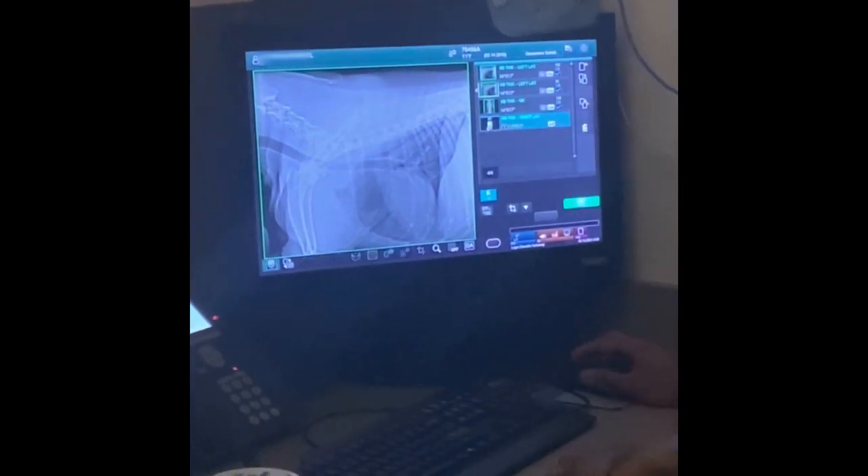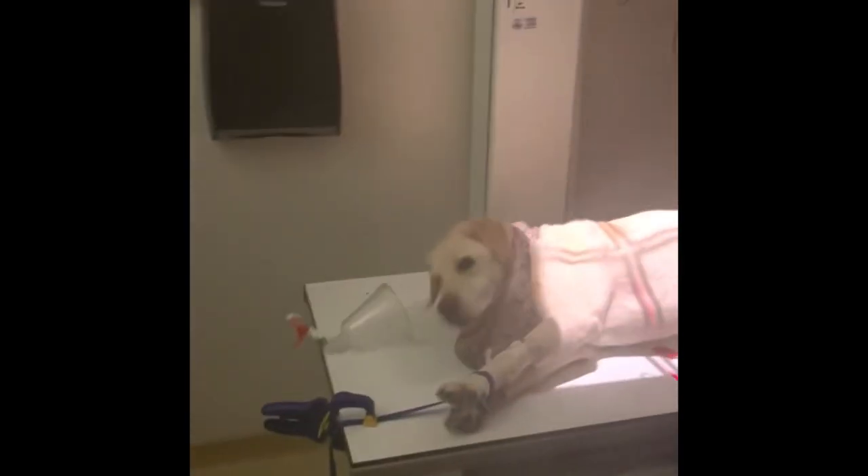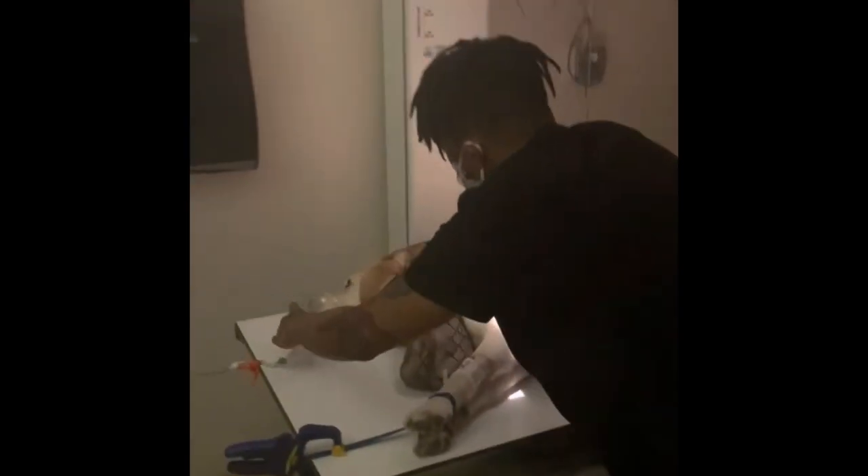The third image is the right lateral, or right side down. I don't roll him over on his back because he's a big dog and rolling on his back can cause a bloat, which would give him bigger problems. Instead, I'll shift his back legs by turning him on his stomach instead of turning him on his back. I'll do the front next, being careful not to wake him up but also holding his head in place. I repeat the same steps as the left lateral, except I use my right marker to show it is a right lateral.